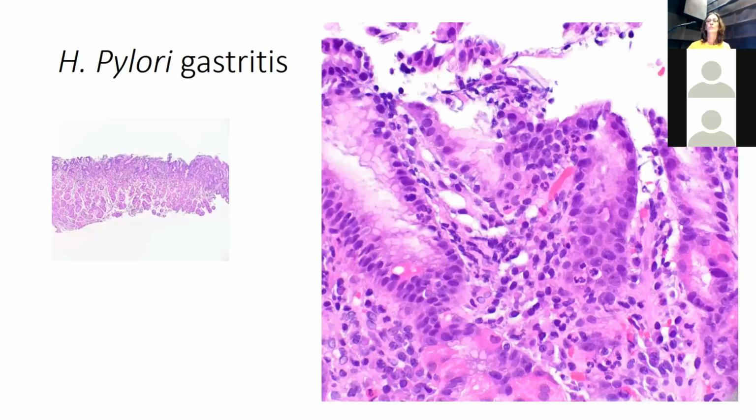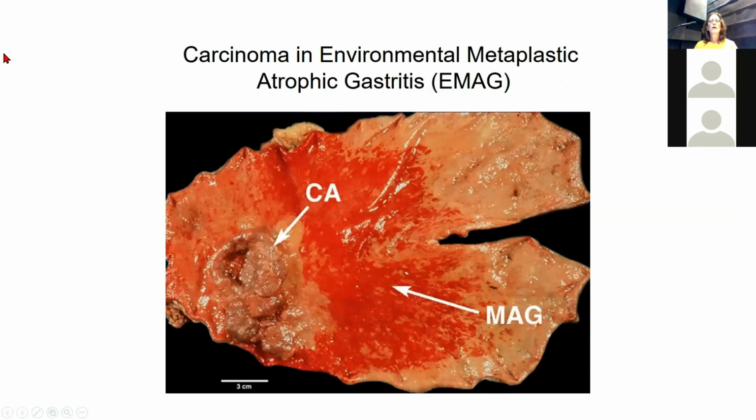All right, so I think everybody in this room knows how to diagnose H. pylori gastritis, but I'll put it into words. Oh, the silly thing doesn't work. Okay, that's fine. So in H. pylori gastritis, you tend to see a superficial lamina propria infiltrate. And of course, everybody knows to look for neutrophils in the mucosa. Oh, now it's decided to wake up. Here's some neutrophils, and those of you who are awake and in the front row can probably see a few organisms here. Of course, after many, many years, one can get intestinal metaplasia.